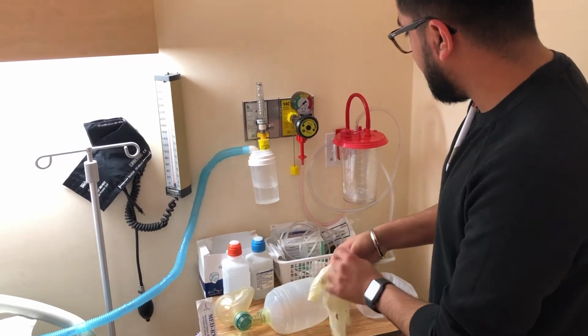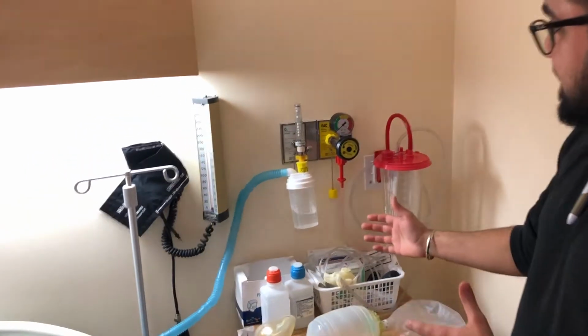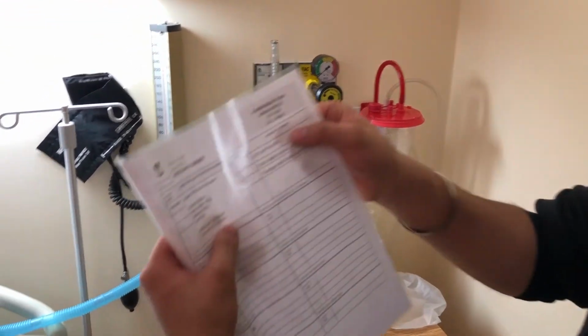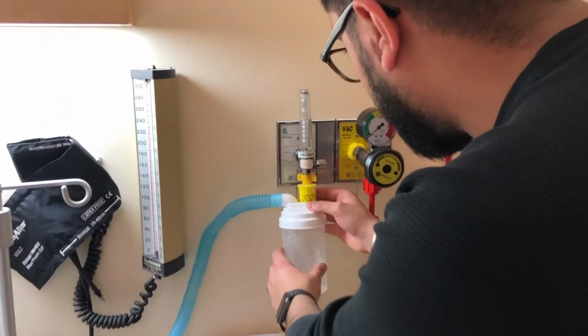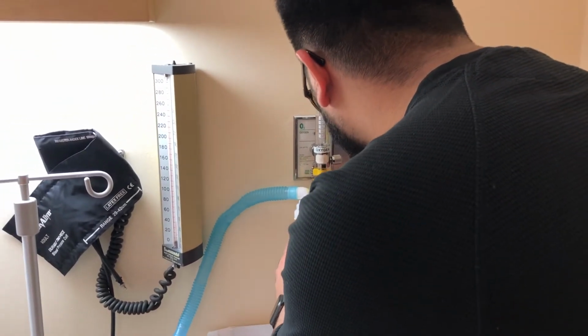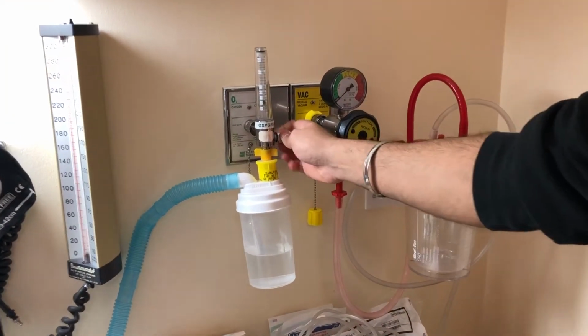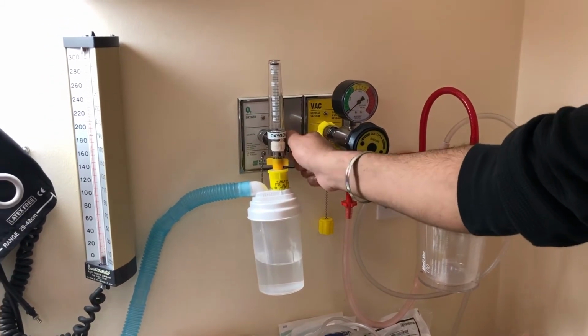What we also want to do is make sure that we have a cold pot here with oxygen attached to it. It's supposed to be at 60%, which is in the doctor's order that we can have right here. So a cold pot at 60%. That is good. And we can verify that with the arrow. It's at 60% right there. We'd want the oxygen working, and you can do that by this. We know the oxygen is working. So those aspects are good.